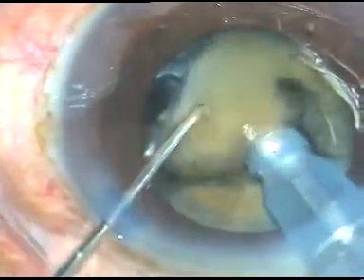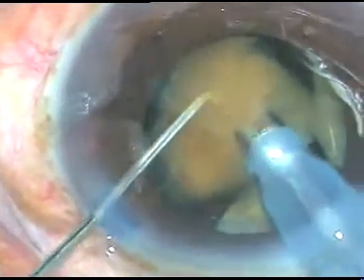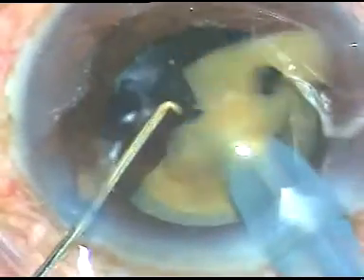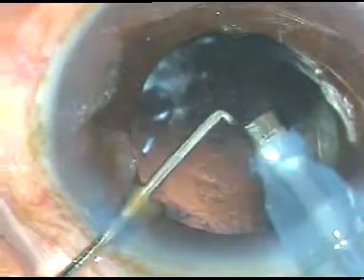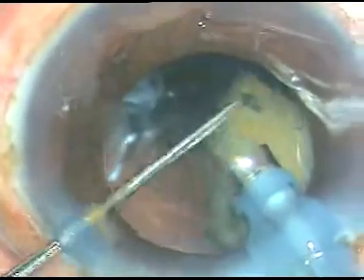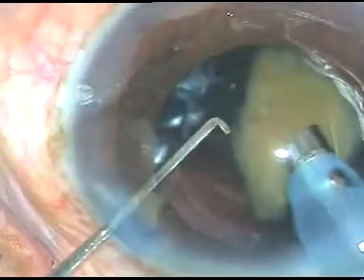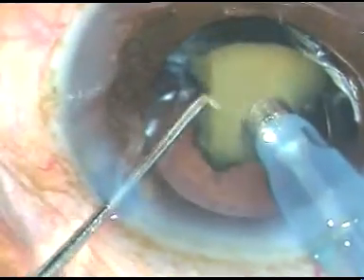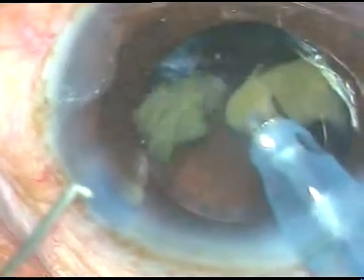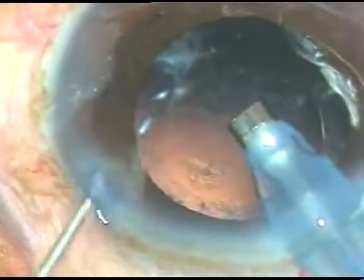Now it is time to emulsify the nuclear fragments. The phaco power was 65%, flow rate 45 ml per minute, and vacuum was 450 mmHg. Two fragments have been emulsified. This is the third nuclear fragment, and one more fragment is there behind the iris — it is brought to the center of the capsular bag and emulsified. There is also a small nuclear fragment at the side port, which also comes out.